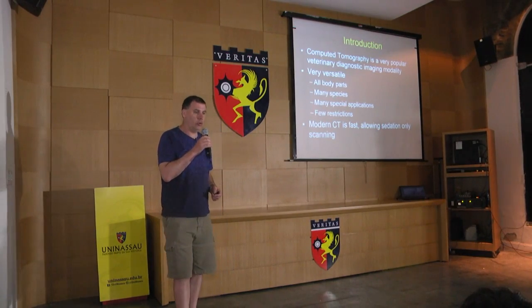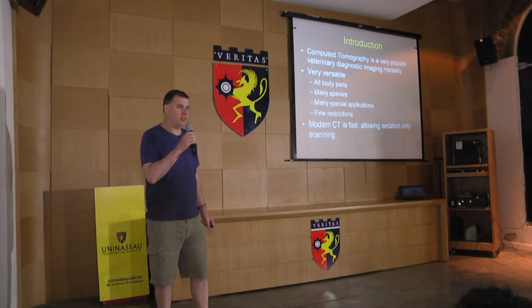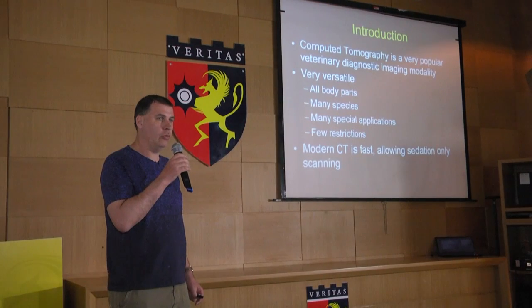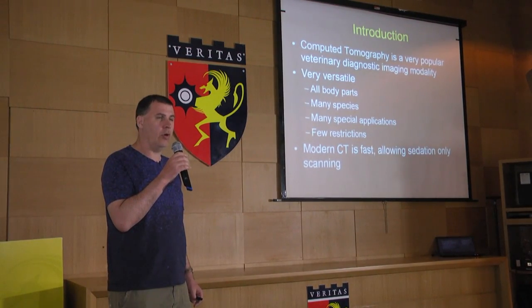So computer tomography is a very popular diagnostic tool in many countries, and increasingly also in Brazil. One of the advantages of this imaging technique is that you can use it for every body part. So it's very, very versatile, and it is very good for almost any species that you can fit into a CT scanner.